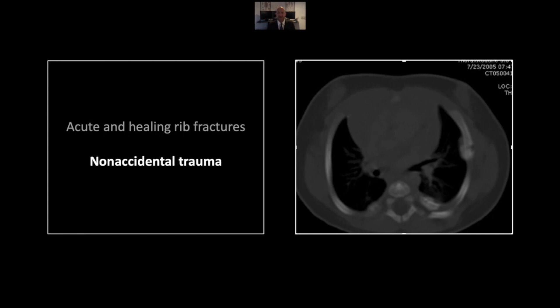Certainly this is something everyone will see many times in their career. It's a life-saving diagnosis — as my pediatric attending used to tell me, miss a pneumonia and that patient will likely return to the ER, miss a rib fracture and that patient likely won't. Here is a classic example: multiple rib fractures in different stages of healing. You can see in the left lateral ribs there is significant callus formation around a subacute fracture.